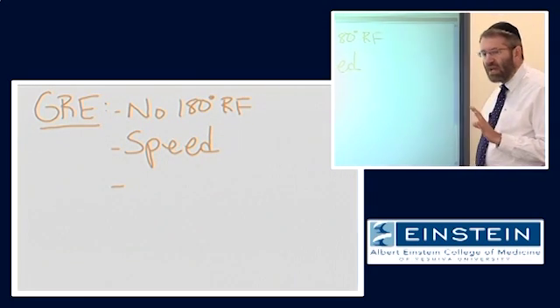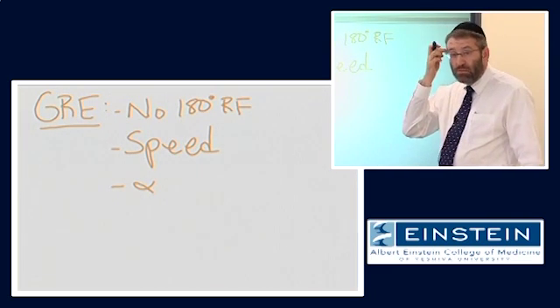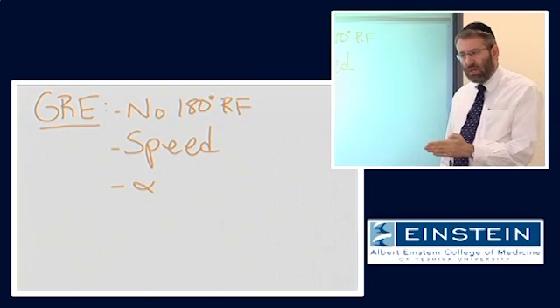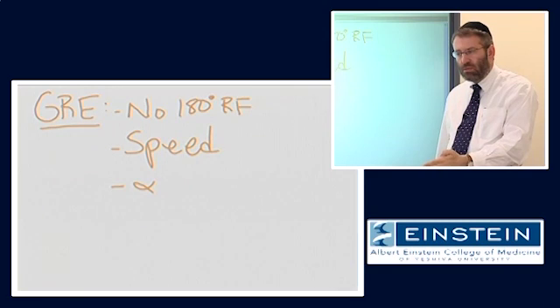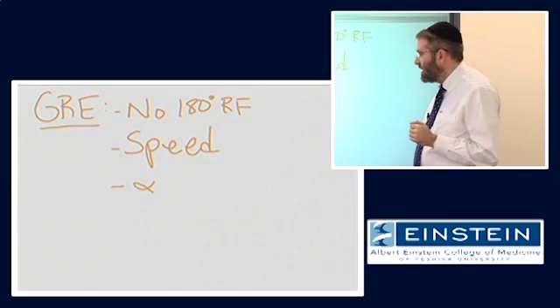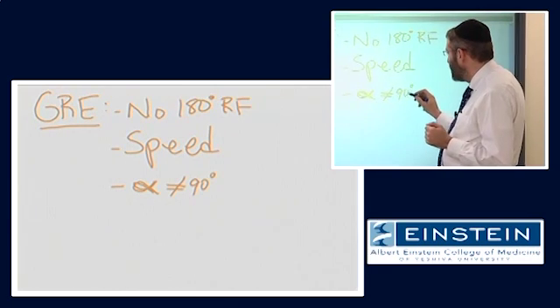Okay. The other thing that someone who knows a little bit about MR will probably tell you is that they can always spot a gradient echo image based on the parameters by looking at the flip angle, which is sometimes given the symbol alpha, meaning how many degrees the magnetization tips. Now, everything we've talked about until this morning has assumed that we turn on our RF and rotate the magnetization 90 degrees. That's generally true, but it's not universally true.